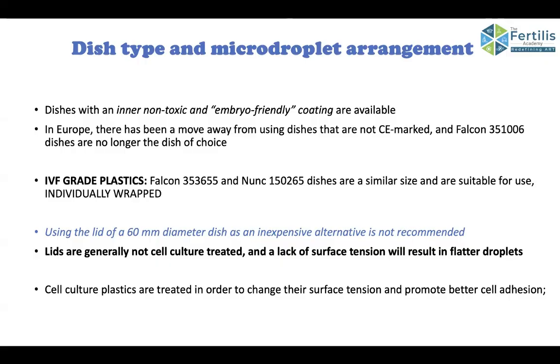The lack of surface tension will result in flatter droplets, so it might not be a cost-effective idea. Cell culture plastics are treated in order to change their surface tension and promote better cell adhesion. So always culture on the surface which is meant for culture.